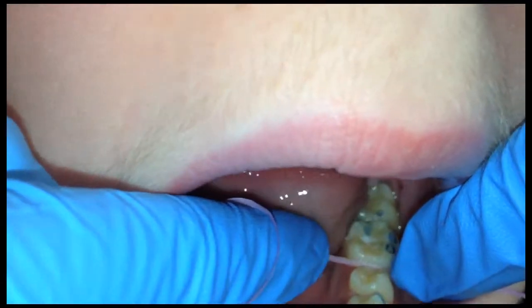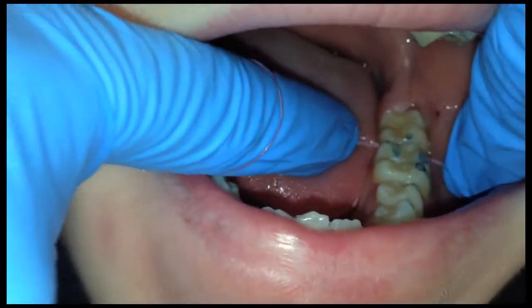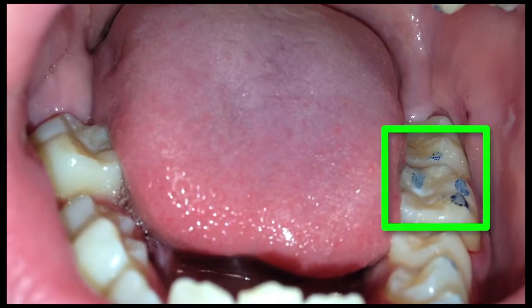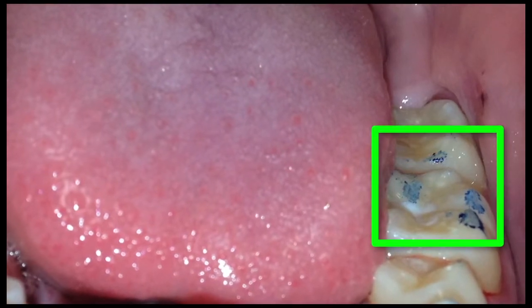The last thing you want to do is check with dental floss to make sure that no sealant material accidentally lodged interproximally. If there are excessive high areas, the sealant should be removed and replaced. Trying to adjust with a dental burr will cause the sealant to fracture, so it would need to be redone anyway.